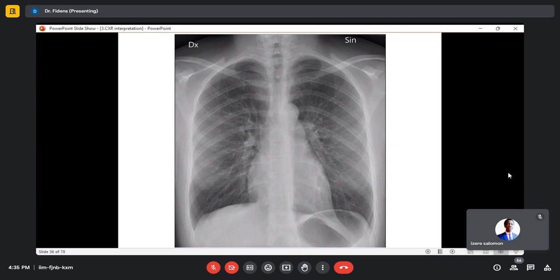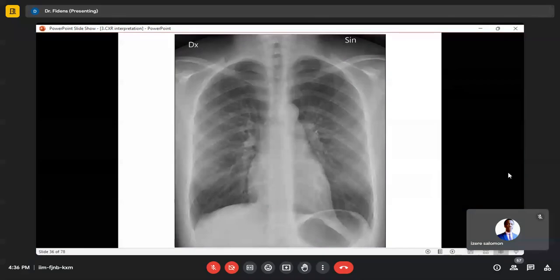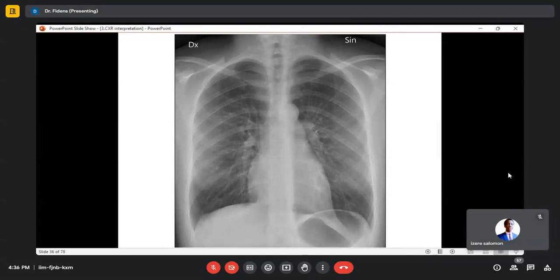Listen, can I answer the question? Radiology is done by people who know anatomy. The prerequisite is anatomy. If you are struggling in anatomy, don't come to radiology. Trachea is in which part among those 4? Trachea is in which one?